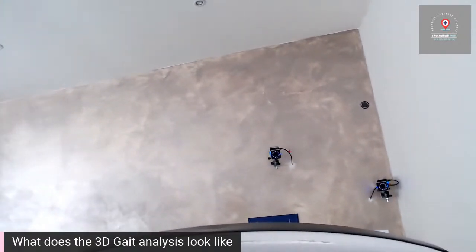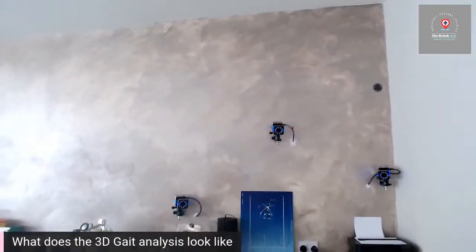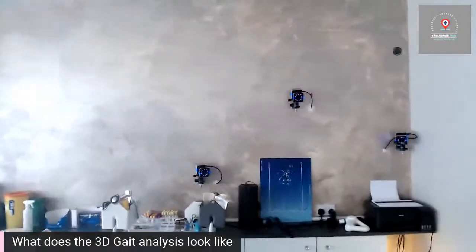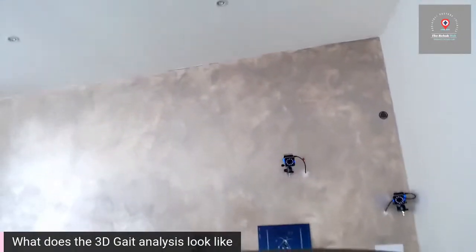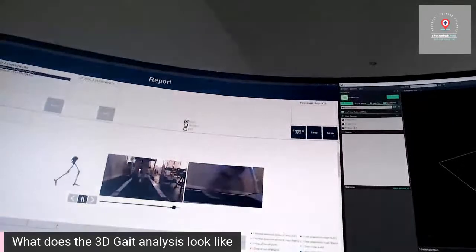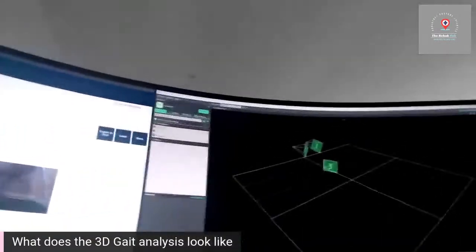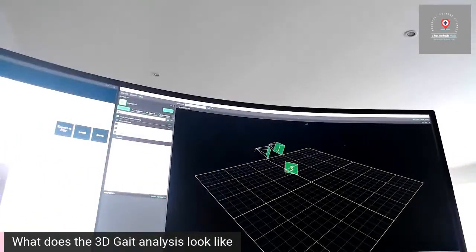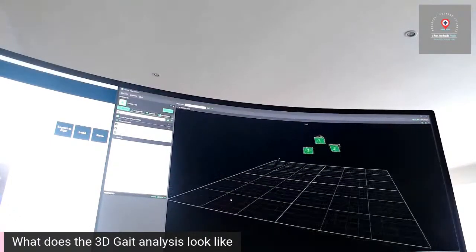So those are Vicon infrared cameras that we have. So you can all see that. Yeah. So there's 3 of them at the back, and then we have the treadmill here in front of this. And then what we then do, if you've watched any of our sessions, we put the client into a 3D environment. So if you see over here, this is the Vicon software. And these, the kind of 1, 2, 3, that's the cameras.